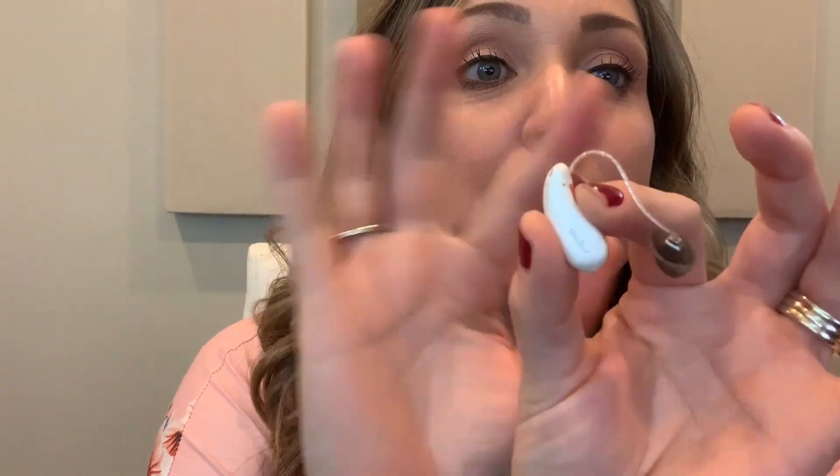These devices are the new Signia Pure 7X and they are small and they are light and they are awesome — but that isn't my favorite part. My favorite part is Signia's click sleeve technology.